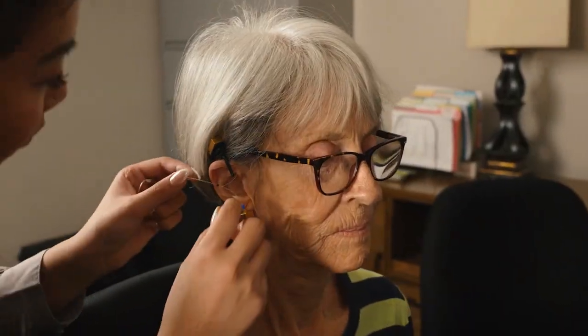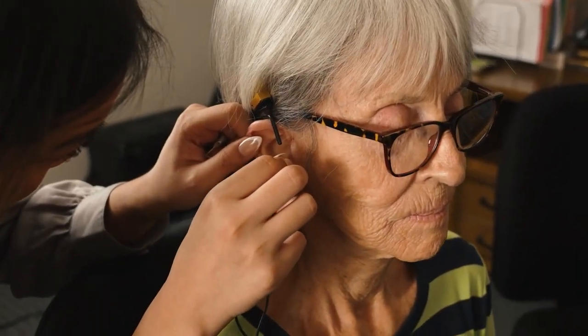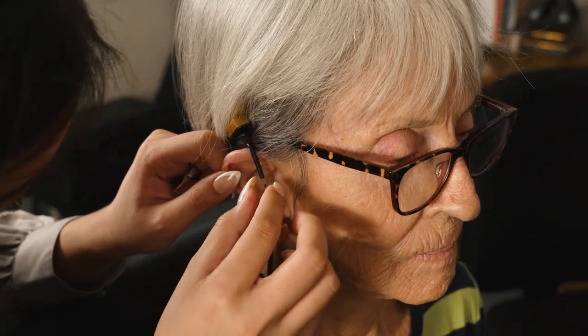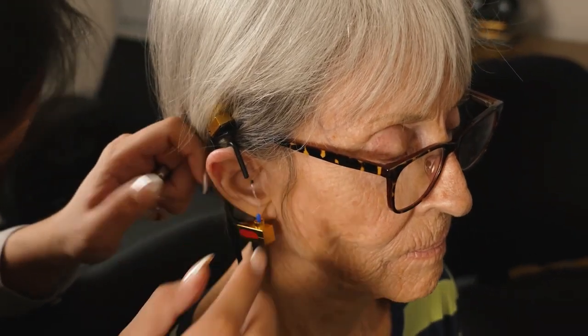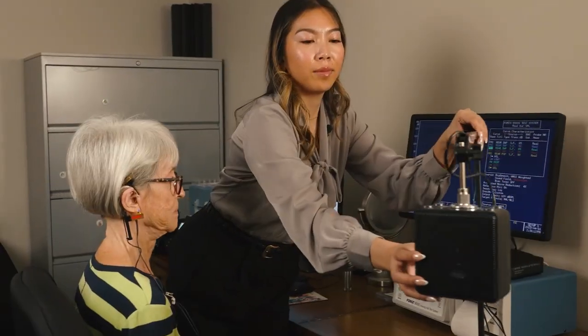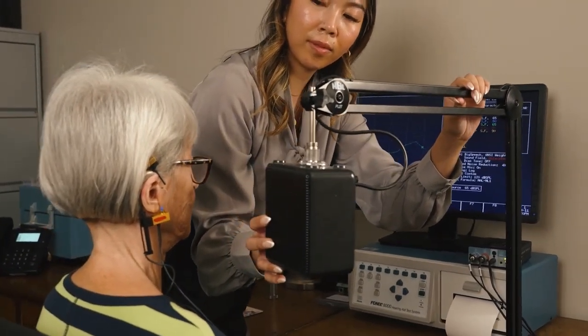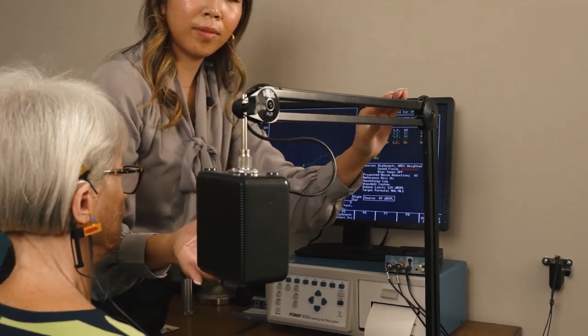A tiny tube from the real ear machine is placed in the patient's ear. This tube is connected to a microphone, which allows what the hearing aid is delivering to the ear to be measured. The hearing aid is inserted on top of the tiny tube, and a small speaker is placed about 10 inches from the ear and the hearing aid. The speaker delivers the sound that is used in measuring the hearing aids.